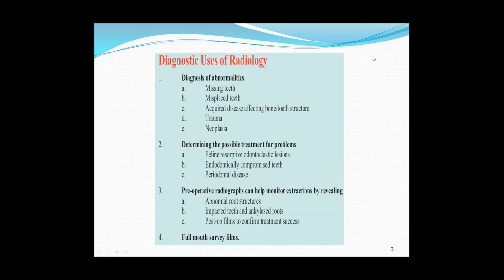In our practice, we also see a large number of puppies, and a lot of them are show dogs, and what we'll do is we'll take full mouth radiographs on the puppies at around 10 weeks of age to see if the permanent tooth buds are present, because a large number of breeders like to sell the dogs and guarantee, well, I suppose you can't really guarantee, but you can ensure that there's actually 42 teeth in the dog's mouth, and you can actually say to the client that's buying the dog, they have all the teeth. So that's always good to know as well. We can discuss that also.